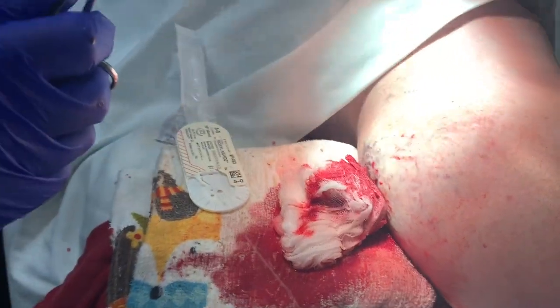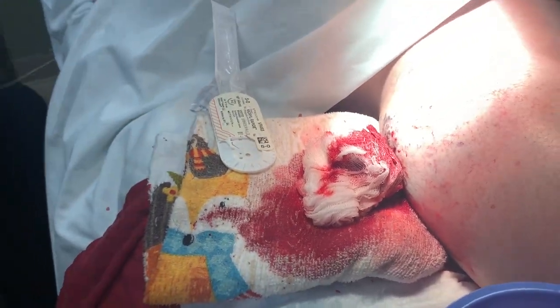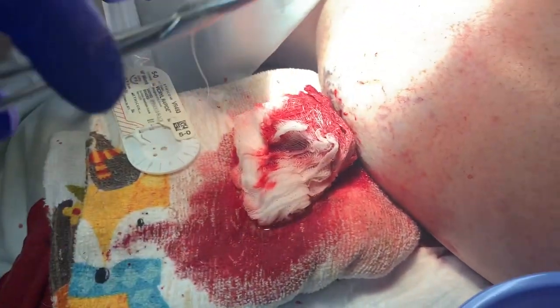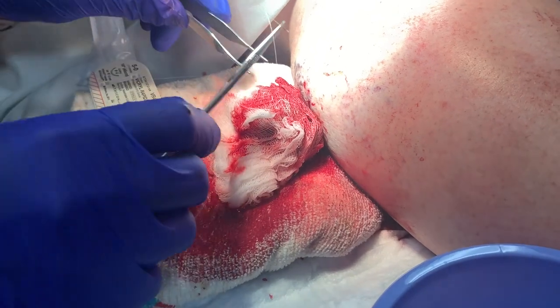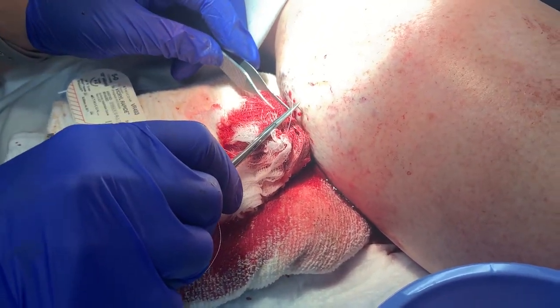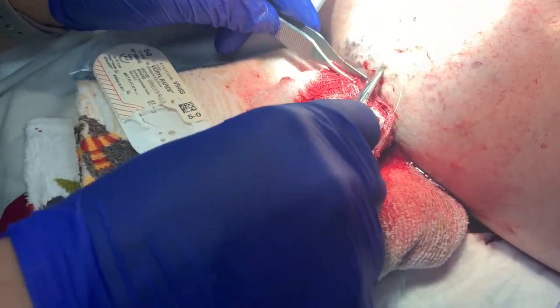So what we're going to do is place a figure-eight suture. It's going to be difficult because we don't want to get a blood bath, and there's no other way to stop this except by coming in.